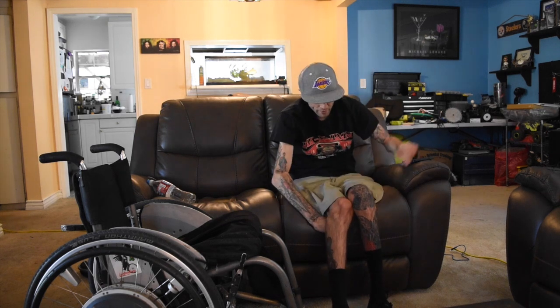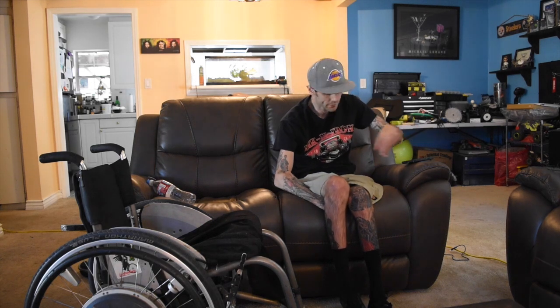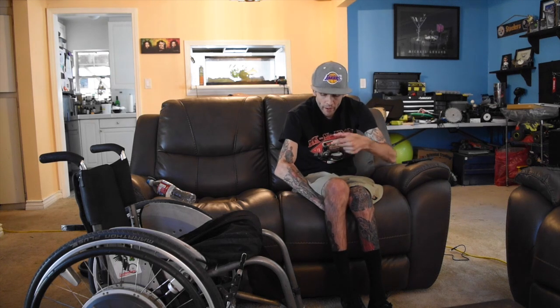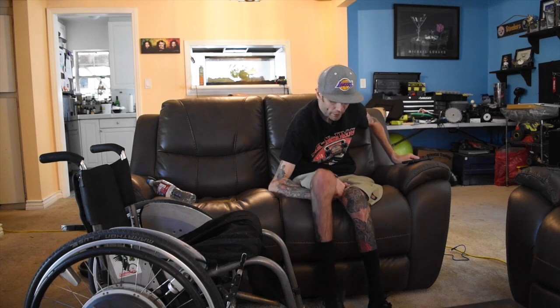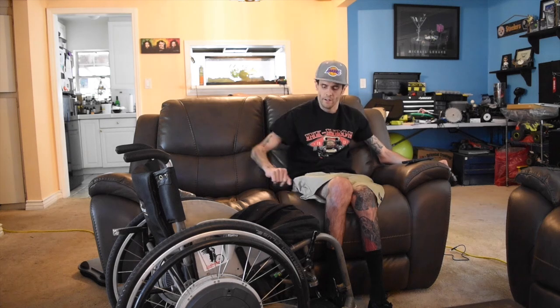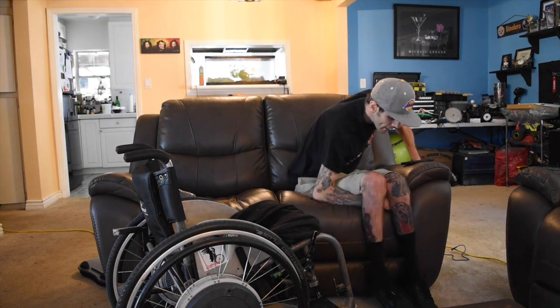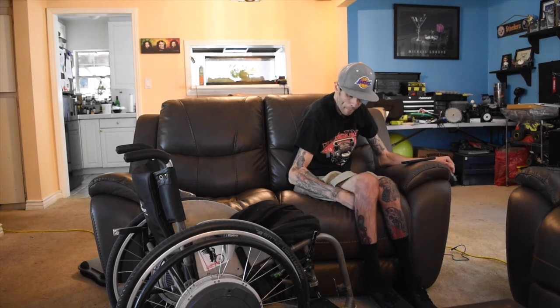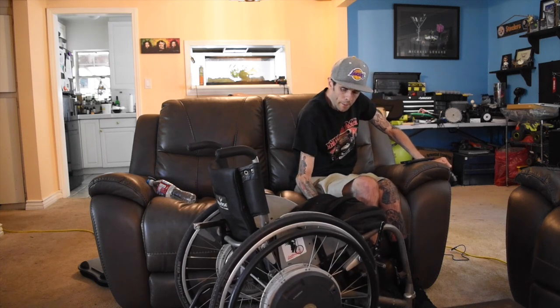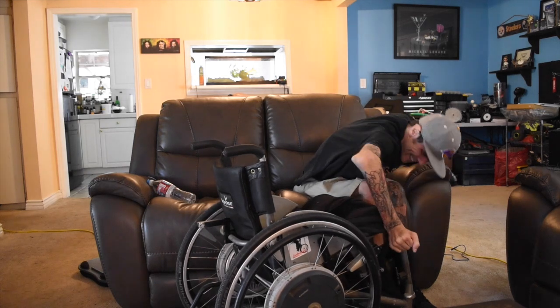So I pop myself forward and get my legs bent back, and now when I reach out for my chair so I have good stability and balance, I'm using the same technique as my transfer. I lean on my elbow and hold some of my weight, just like holding this leg right here, so I can keep a little more balance and pull the chair in. Once I've got the chair in, I try to lean forward and move my legs a little farther over. Try to pull the chair in. Lock both brakes.